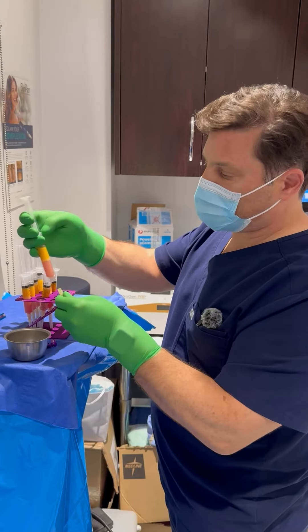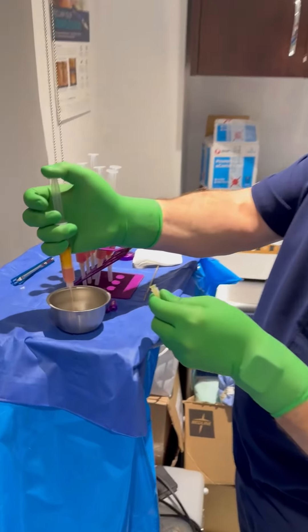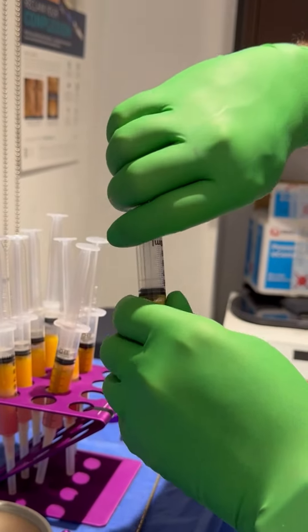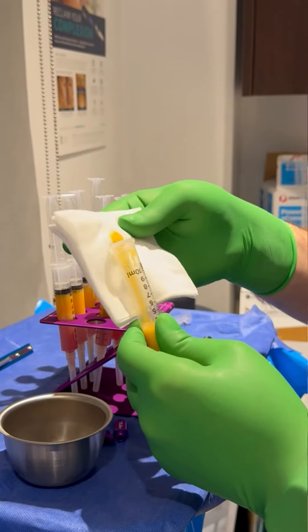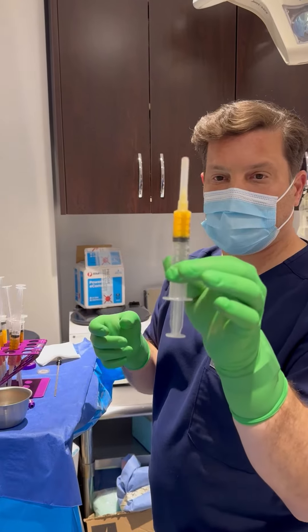The first thing we do is get rid of all that extra liquid, because we don't want to inject that — that's not fat. Up top there's a little layer of oil, and we don't want that either, so the oil leaks out. We now have four cc's of pure fat.